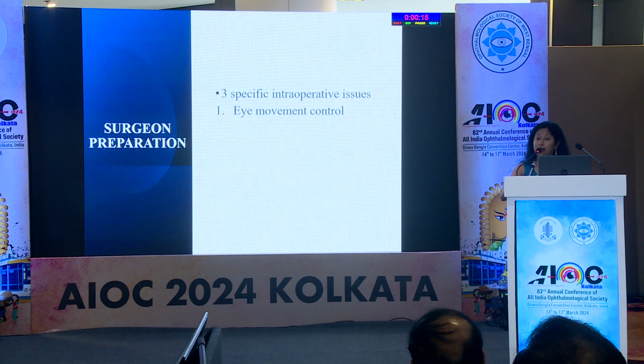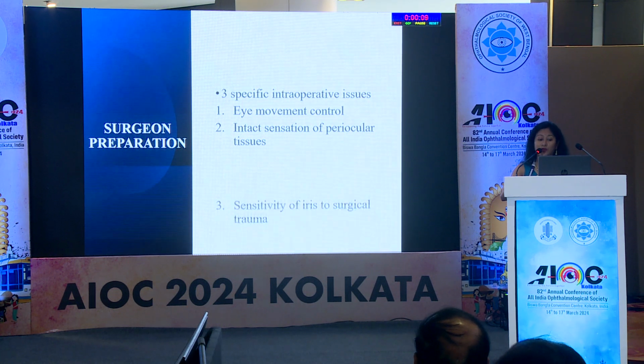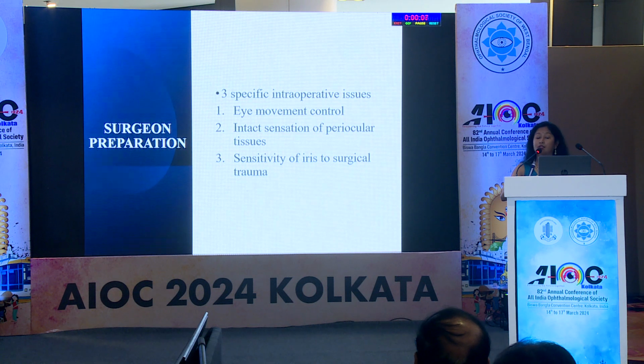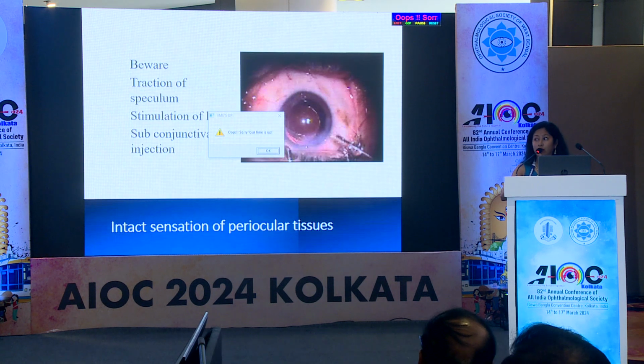We have to understand the eye movement control. We have to understand there is the intact sensation of your periocular tissues and the sensitivity of the iris to surgical trauma. Initially, saccadic movements can be disconcerting, but more forceful movement can create a problem for you.